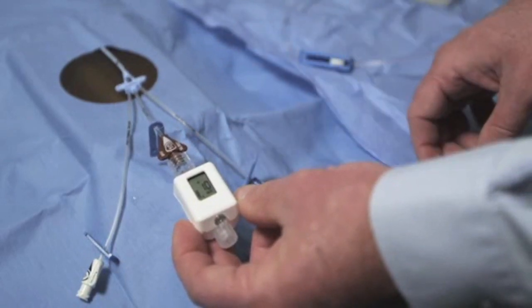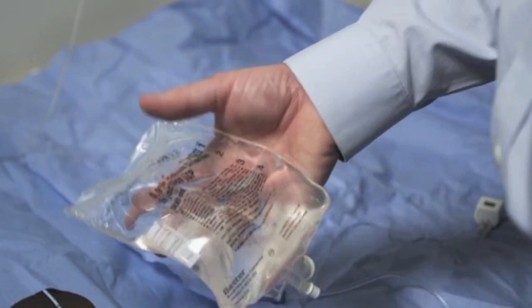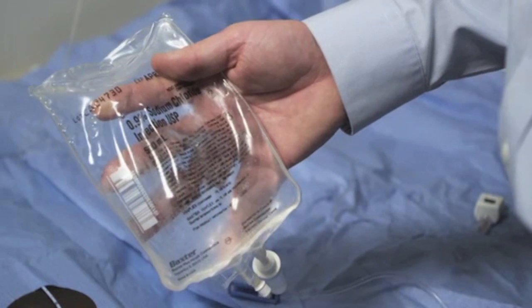For longer-term monitoring, we suggest infusing fluid directly through the device to prevent thrombus from forming at the end of the catheter.